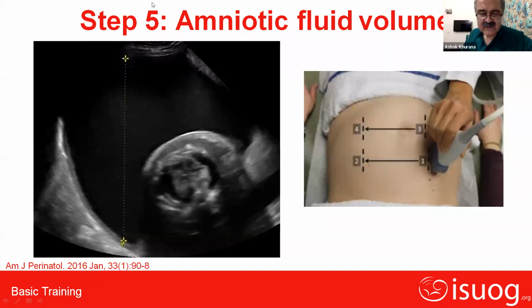If I may answer that question, when we look prior to about 18 to 20 weeks of gestation, we like to look at amniotic fluid in a subjective manner, and we also like to objectivize it. When we try and do an amniotic fluid index in a pregnancy that is usually less than about 14 to 16 weeks, the amniotic fluid index is difficult to quantify. And therefore we go more by the maximum vertical pocket, and we will not use a measurement just by itself. It must be combined with the amount of amniotic fluid that we see around the fetus. I use a rough index in very early pregnancy, and that of course is a first trimester thing. What we have discussed today and what Dr. Ajit has told us today is about the second and the third trimester.